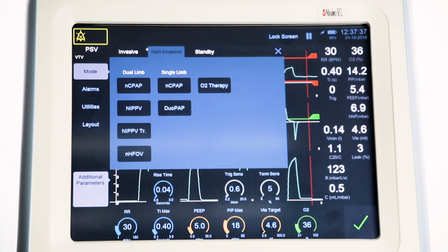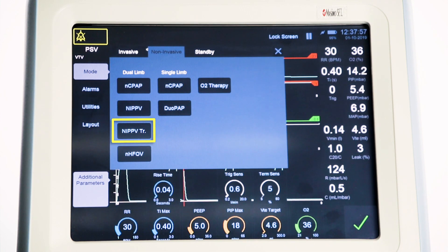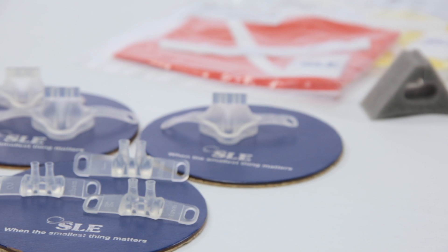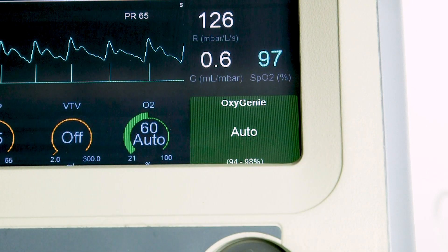The SLE6000 infant ventilator has the facility for four different modes of dual limb non-invasive therapy: NCPAP, nasal continuous positive airway pressure; NIPPV, nasal intermittent positive pressure ventilation; NIPPV triggered, triggered nasal intermittent positive pressure ventilation; and NHFOV, nasal high frequency oscillation ventilation. Each mode uses the same accessories and circuits already described in our previous NIV video. Note that Oxygeni, SLE's closed-loop FiO2, can be used with all dual limb and single limb modes.